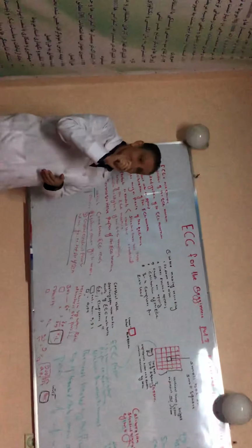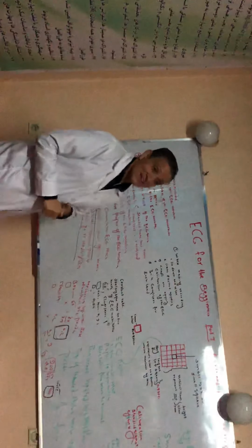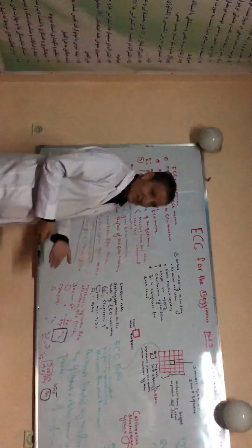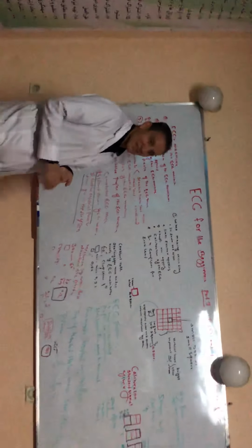The second, all the electrodes should be placed in their own places. It is not necessary to remember which electrodes are involved in which leads. It is important to connect these electrodes in the special places according to their labels. You should connect the limb electrodes: the RA electrode to the right arm, and the LA electrode to the left arm. RL should be applied to the right leg, and LL to the left leg.